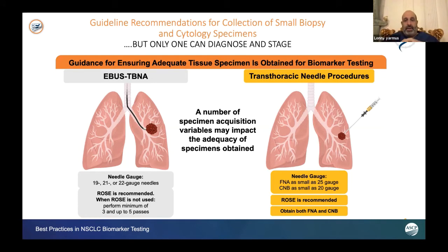There are, as I talked about, two main ways of doing that now: EBUS-TBNA and CT guided or transthoracic needle biopsy. One incredibly important piece from my end is what separates those two is EBUS's ability to stage and diagnose. So a CT guided biopsy is an outstanding procedure to go after a primary lung nodule or lung mass, but it's not typically used for mediastinal sampling, just given the risk and depth that the needle would have to penetrate. EBUS, on the other hand, can do both.